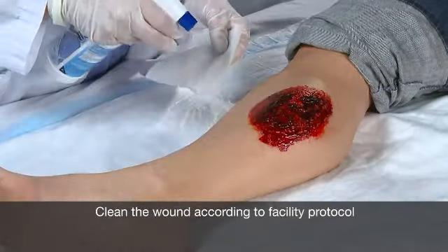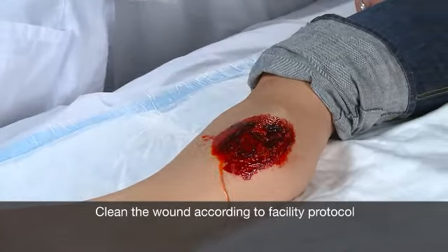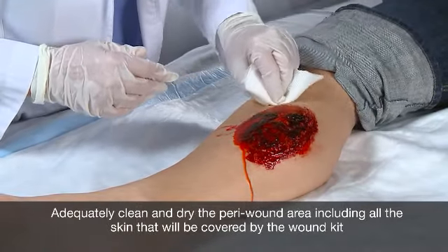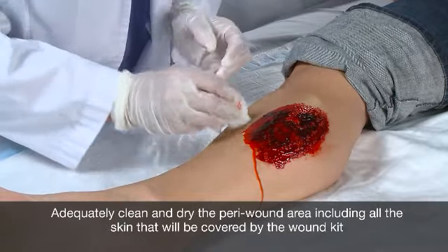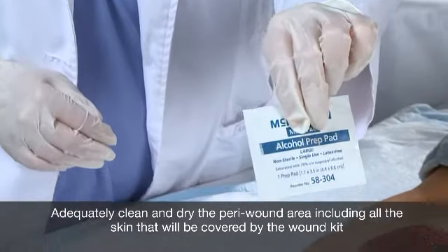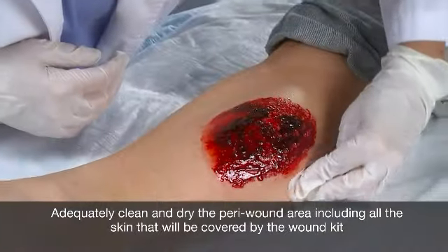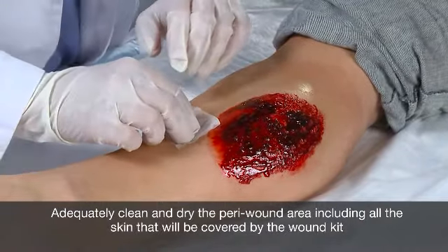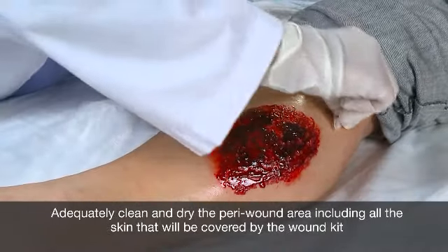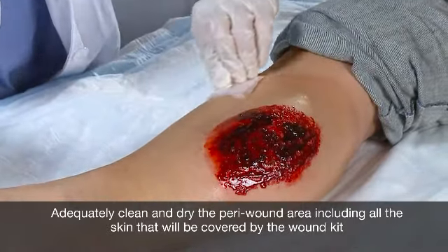After that, clean the wound bed according to the facility's protocol for applying a Negative Pressure Wound Therapy Wound Kit. Take special care to ensure all the skin that will be covered by the wound kit is adequately clean and dry. It is recommended that you use an alcohol-based cleaning product for the peri-wound area and allow it to air dry before the wound kit is applied. If you are using a non-rinse wound cleanser, you may need to rinse with normal saline or sterile water. The skin needs to be rinsed and dry in order to get proper adhesion of the wound kit.